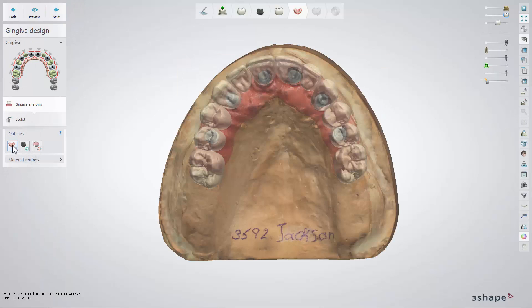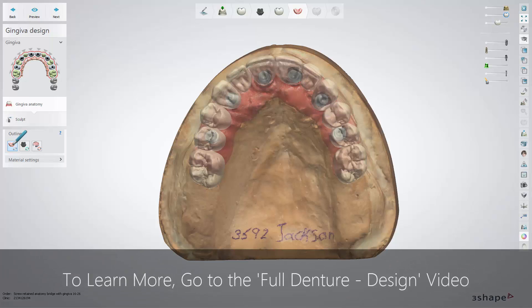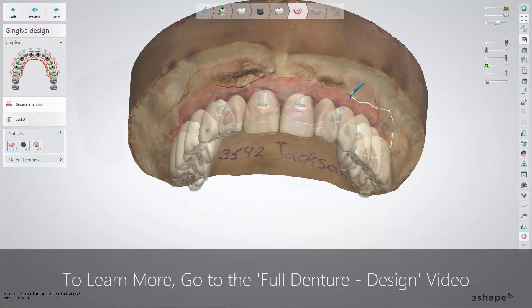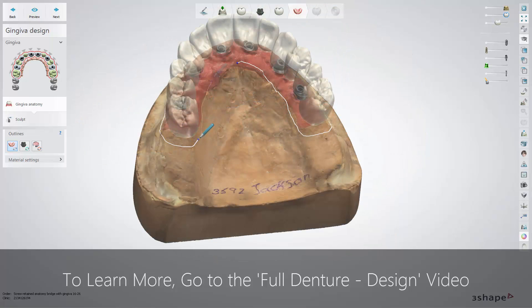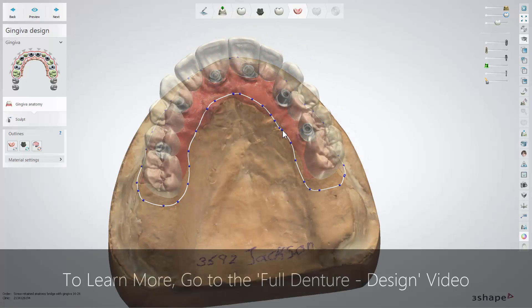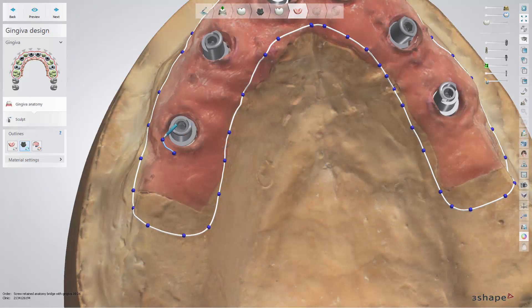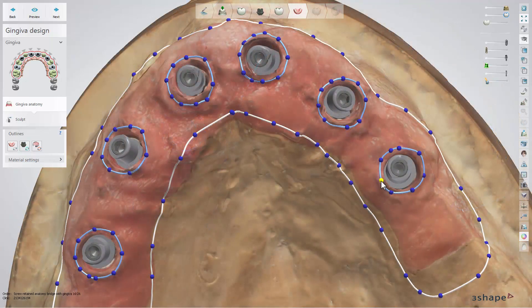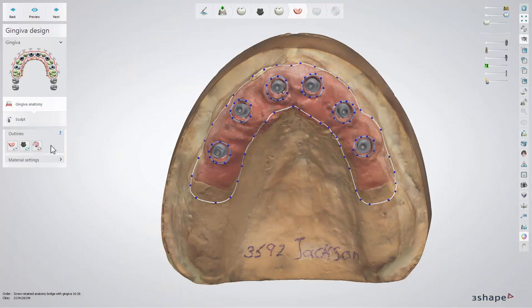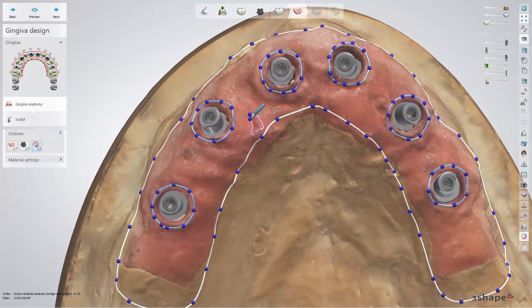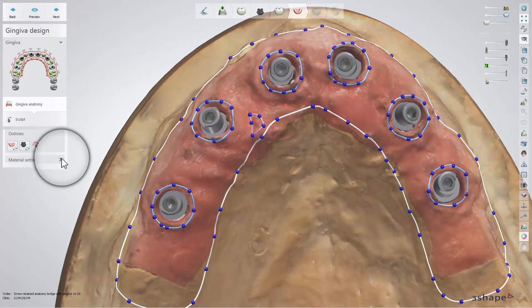Select Draw artificial Gingiva outline and then use the pencil icon to draw the Gingiva outline, which can be modified if needed. When the Gingiva is outlined, click on the Draw implant openings in artificial Gingiva button. Optionally, you can draw relief zones using the Draw relief zone button if necessary. All settings related to Gingiva can be set in the Material settings drop-down menu.